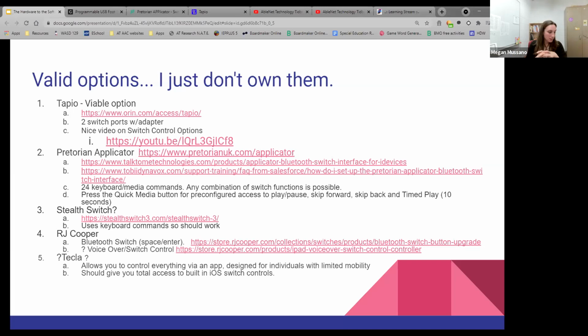Actually, one thing I would recommend that I've tried with some of my students with cortical vision impairment, or CVI, is you can program a Big Mac or a Step-by-Step to be a switch. I can't remember how off the top of my head, but if you have the adapter cord plugged in, you can program it so that when you hit the Big Mac, it will talk, and at the same time, it will also function as a switch and activate another toy. If you read the directions, it's available on a Step-by-Step or Big Mac.